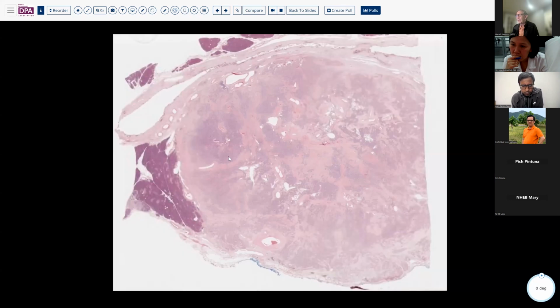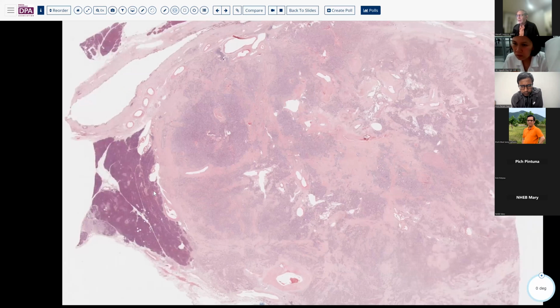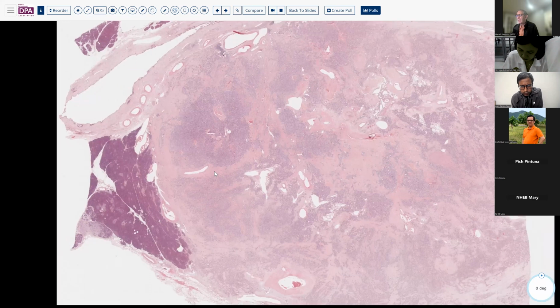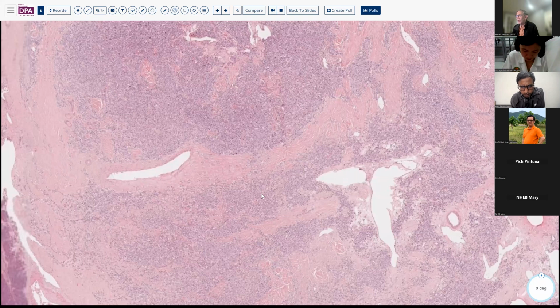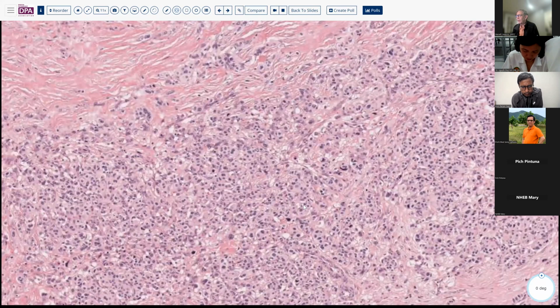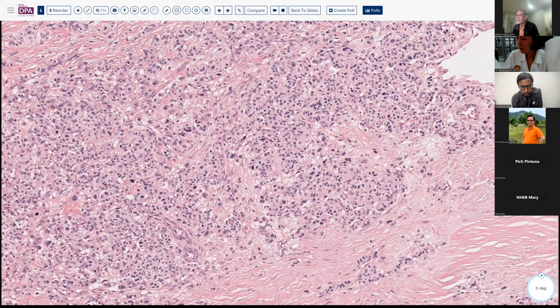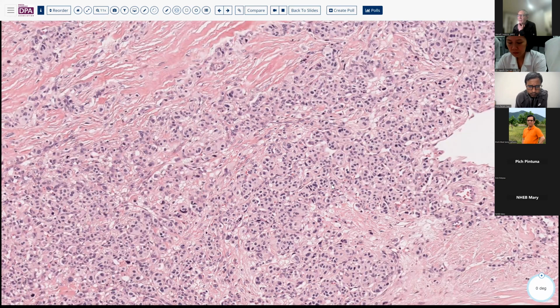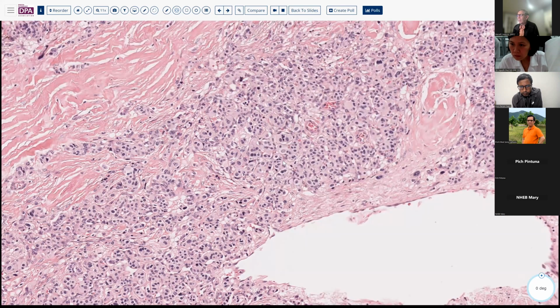And here's one more neuroendocrine tumor. Again, notice a lot of hyaline tissue here, but very sharply circumscribed, not really lace-like and so forth, but differentiated enough that you'd look at this and say, oh, this is a neuroendocrine tumor. Now, again, with this small packeting, you might raise the question of, could this be a paraganglioma? And in that case, I think you would want to do an additional S100 stain to see if you have the sustentacular component as well.